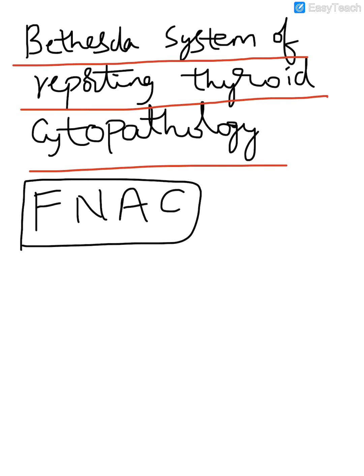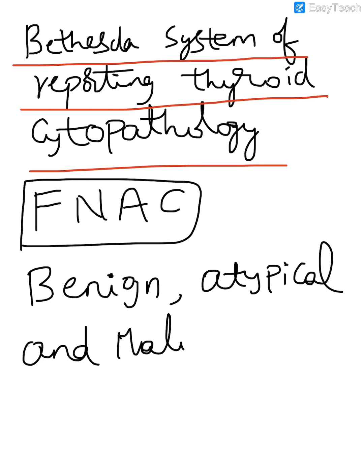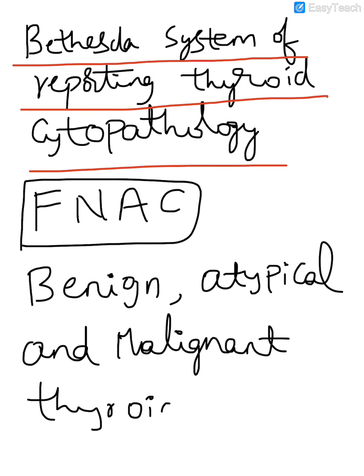This Bethesda system of reporting thyroid cytopathology is useful to differentiate benign, atypical and malignant thyroid lesions.